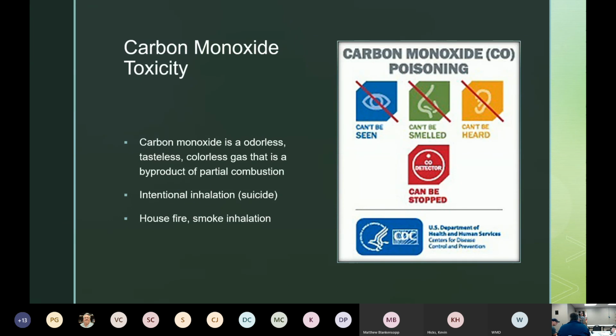So most people listening to this lecture have the rainbow sensors with either Physio-Control or Zoll, and I think both of those manufacturers have the capability that when it gets over 10% SpCO, it sounds an alarm and switches from SpO2 to SpCO. Okay. So that's another reason to use the pulse ox on the monitor and not a separate fingertip sensor. There is a problem with maintenance and keeping up with the sensors. It's very expensive, and I've been fighting that battle for a long time, but that's one issue.